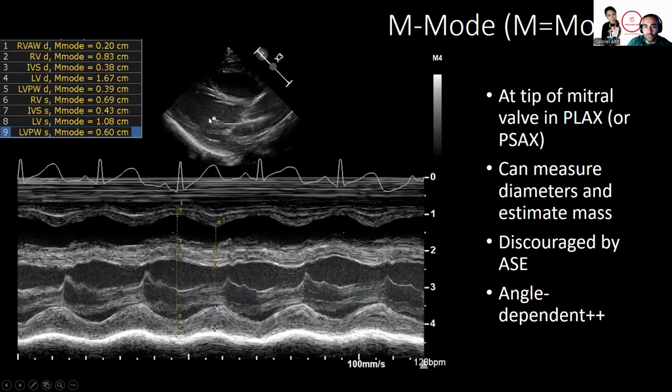But here you can see the two leaflets, and you can see the anterior leaflet here, and here you can see the posterior leaflet, which is this one. Okay, and this anterior leaflet during contraction is getting very close to the septum here. You can see that it's getting closer here. And so it informs you, well, this is actually during filling, but this E-point has been used in certain literature of the POCUS in emergency. We don't typically use that in the neonatal period as a marker of true cardiac function, to be honest.